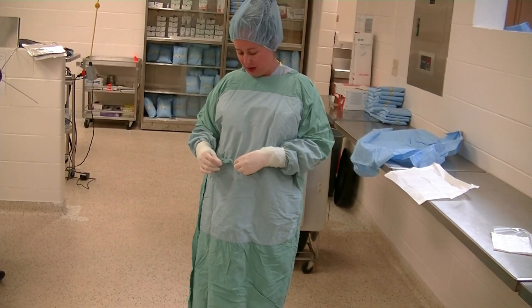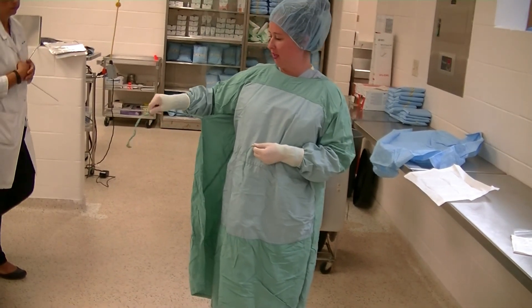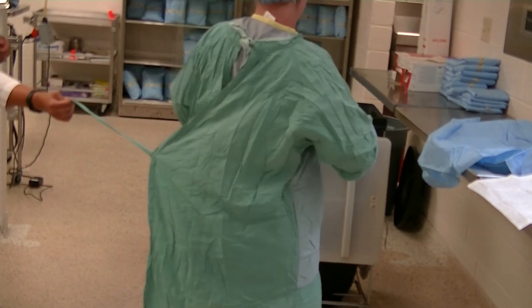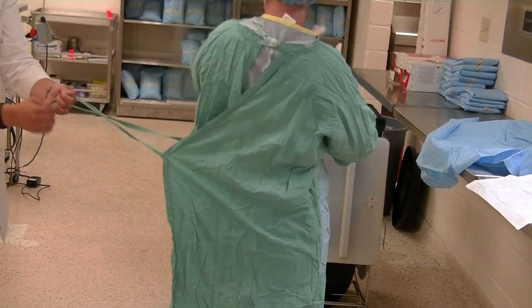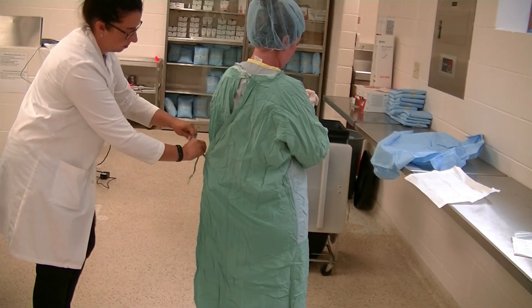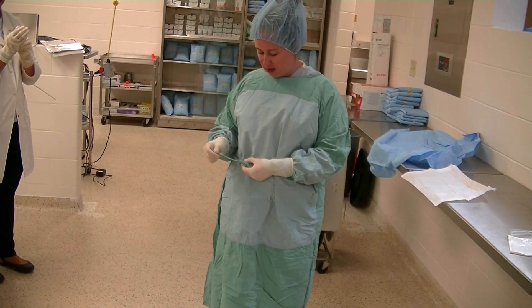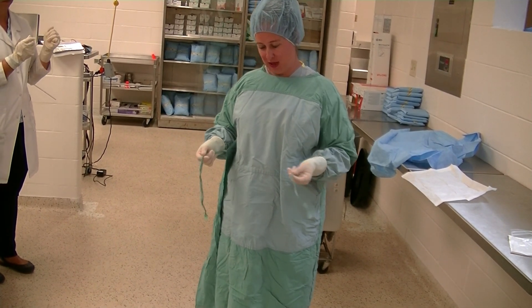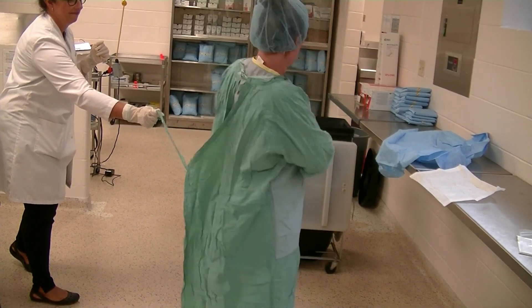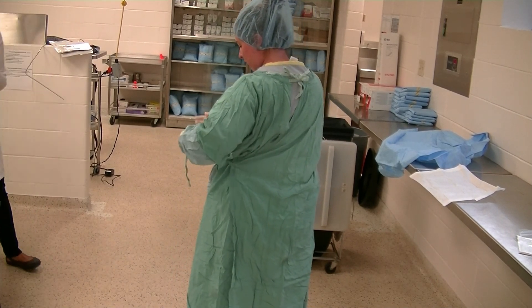Finally, we tie the end of our gown. As the sterile person, untie your gown and pass one side to a non-sterile assistant who holds it; you turn, then pass the other side so they can tie you. Alternatively, if you have a sterile assistant, pass the tie to them in their sterile gloves, turn, take your tie back, and tie your gown yourself.